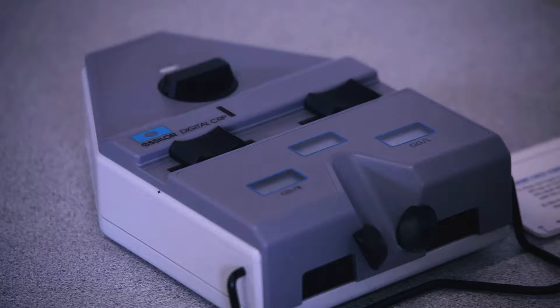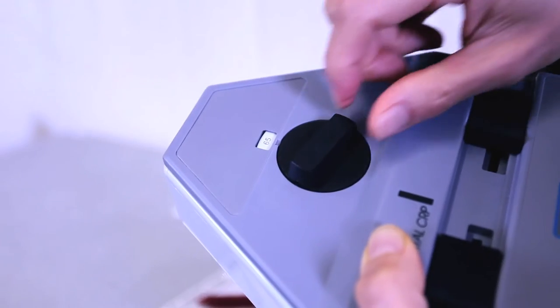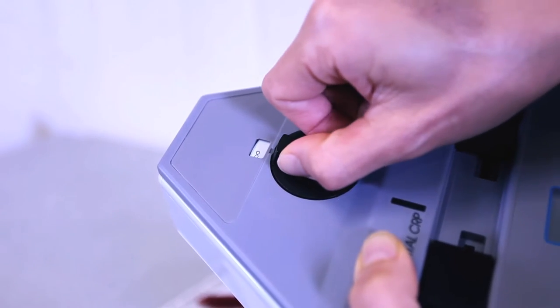It's vital that you make sure you are at the same height as your client — use a wall mirror to do this if you can. The corneal reflex pupillometer is the only instrument designed to measure the distance between the visual axes and not just the distance between the pupil centers. Before you take the distance PD, set the working distance knob to infinity.